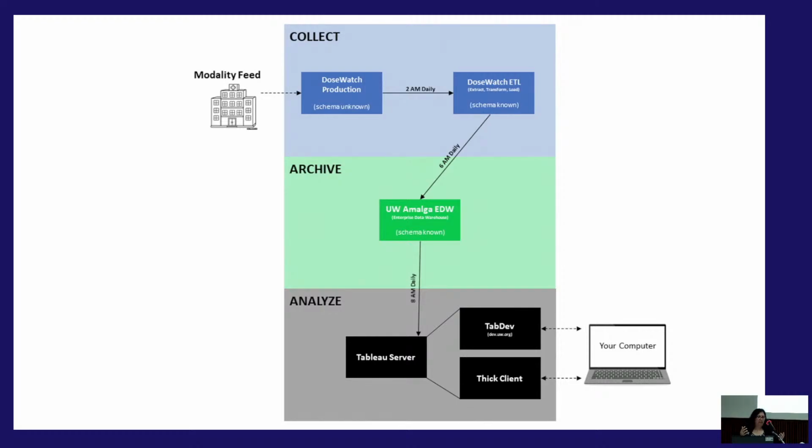Actually, what I saw this morning with Radiometrics was very impressive. You can actually do things. You can't do a lot of that in Dosewatch. So we connect all our Dosewatch data to a Tableau server, and then we can just pull it on our computer wherever we sit, and we can slice and dice the data the way we want.